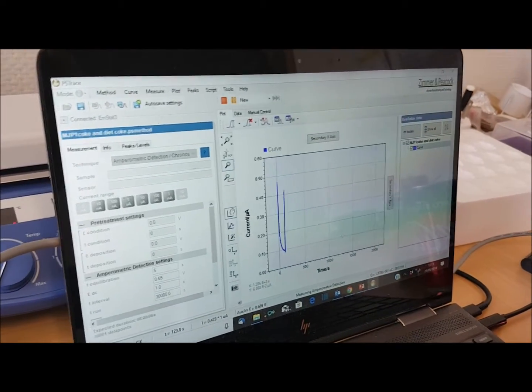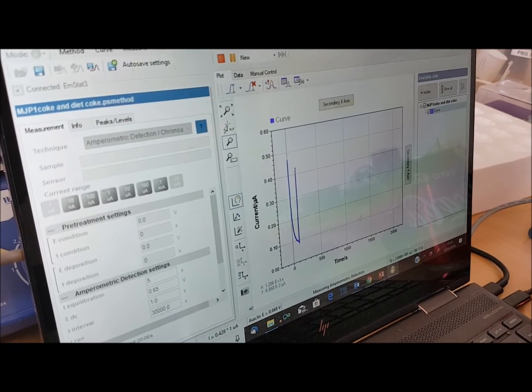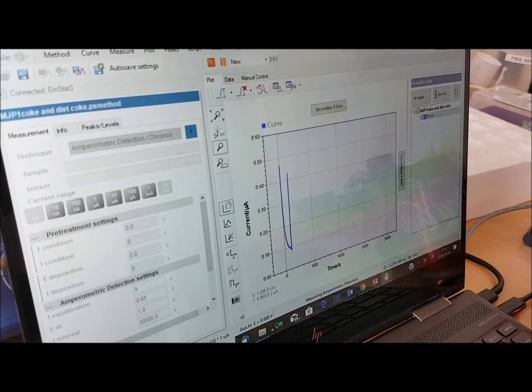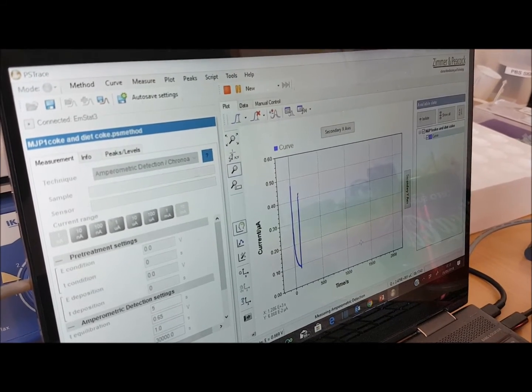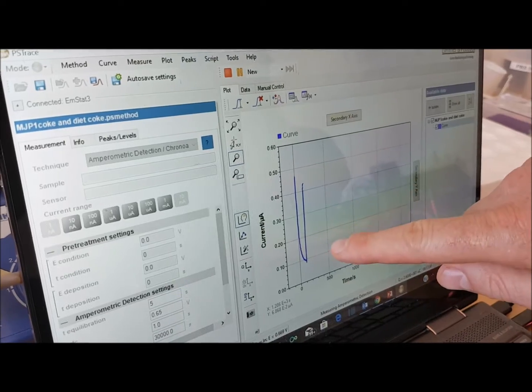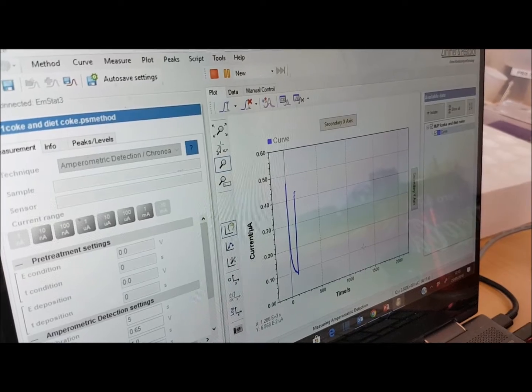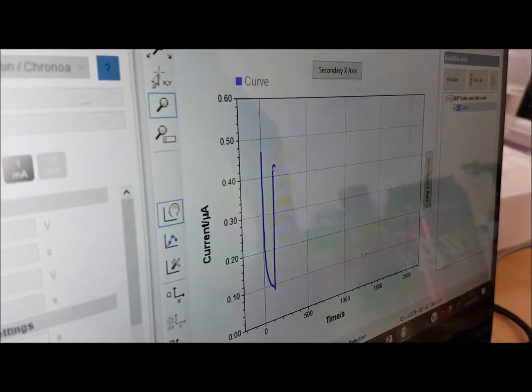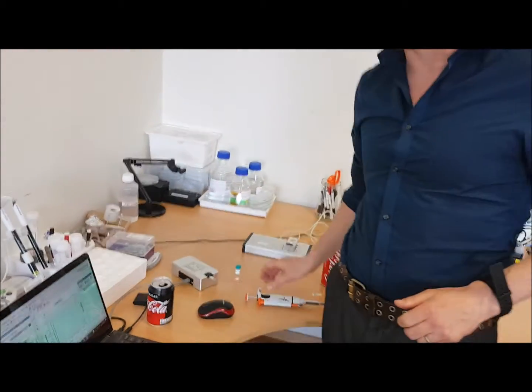There was no glucose on the sensor — it was just reading Diet Coke. We've put on real Coke with the sugar in it, and the signal jumped up immediately because the enzyme is specific to the sugar. We're now getting the production of a molecule called hydrogen peroxide, and that's what we're then oxidizing.